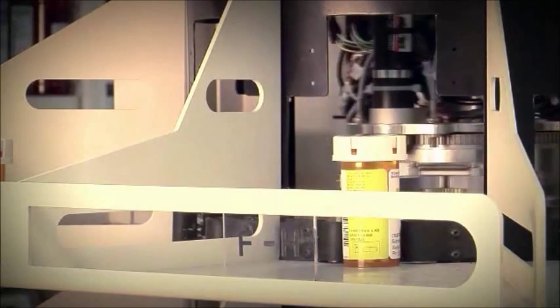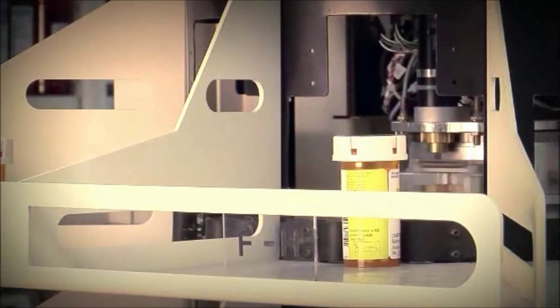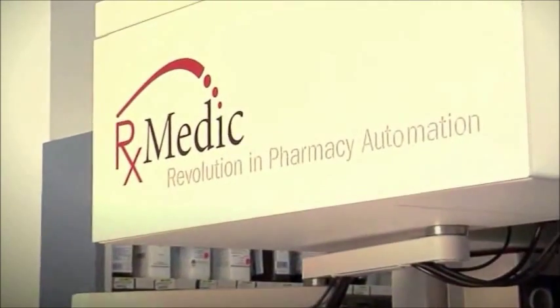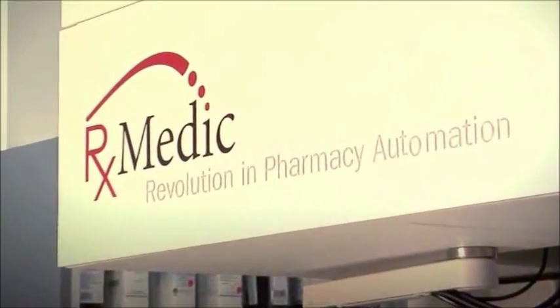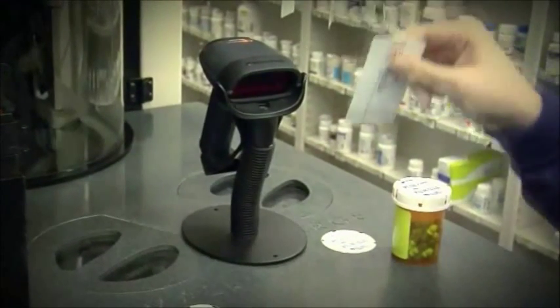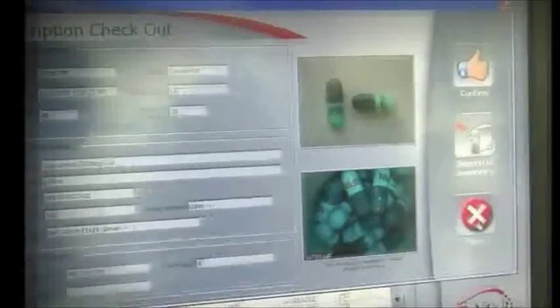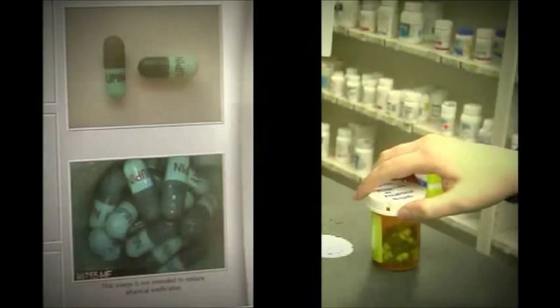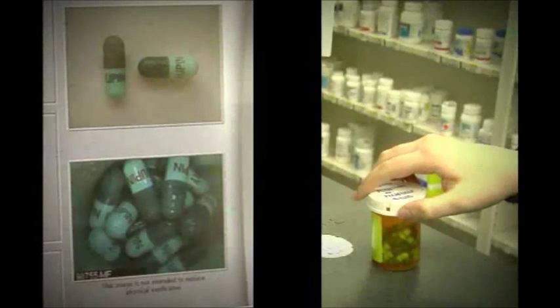The prescription is then placed in a correlating area where completed scripts are stored alphabetically by the patient's last name. Checking out a script is as easy as placing the vial in front of the barcode scanner. This displays information about the script and allows you to visually verify the picture of the contents of the vial with the stock image of the medication dispensed.